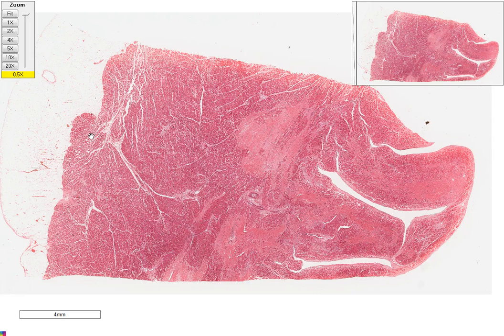This virtual slide shows a piece of myocardium or myocardial tissue, with this being the pericardial surface with some epicardial fat, this whole section being the myocardium, and right over this end, this is the endocardial surface. So we can see that there is this paler area over here, which is quite irregular, and other areas are more densely eosinophilic. So let's look at the densely eosinophilic areas first.